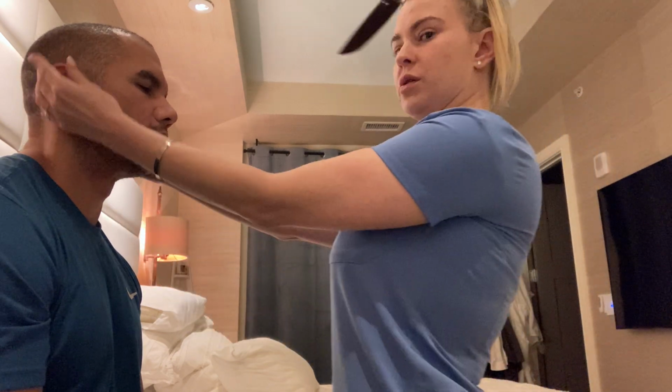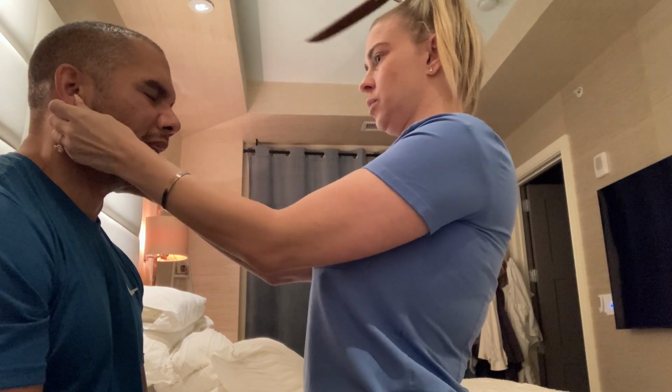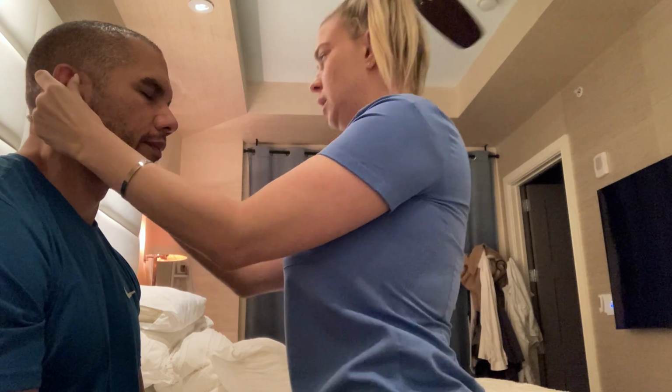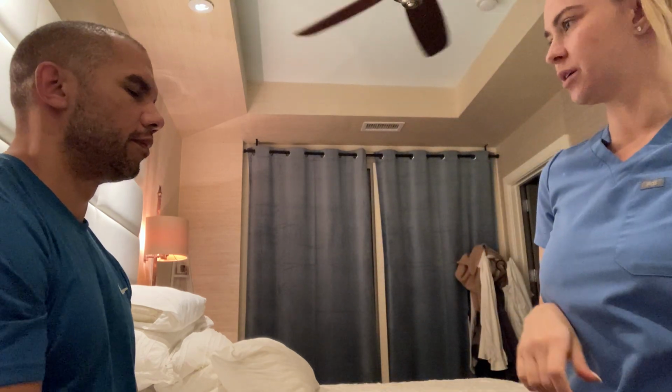Randall, have you noticed any drainage, change in hearing, any lesions, bumps, pain, any redness? No. Okay, very good. I will look at the surface of the ears and inspect the auricles and the surrounding tissue. Okay, both are smooth and pink, no lesions, no deformity, no lumps. Next, I will take my otoscope and look inside your ear, Randall.